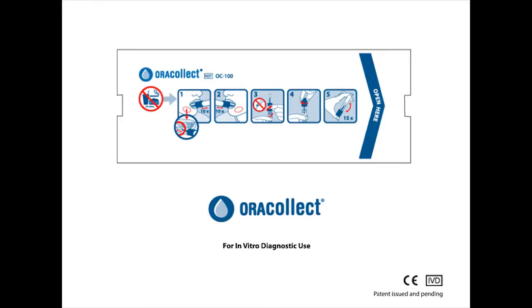ORAcollect is designed for the self-collection from human oral samples. Each ORAcollect packaging contains one collection kit for single use.